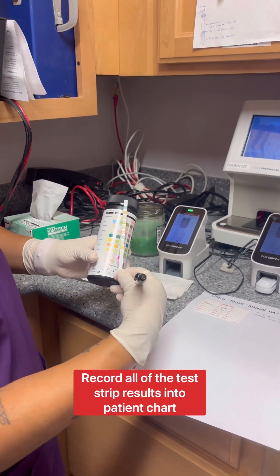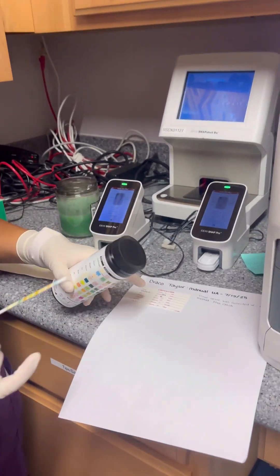So these are the results for this one. You can see that I put all my answers on this chart.